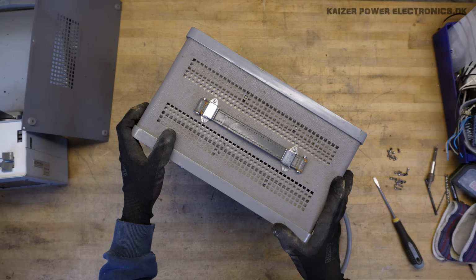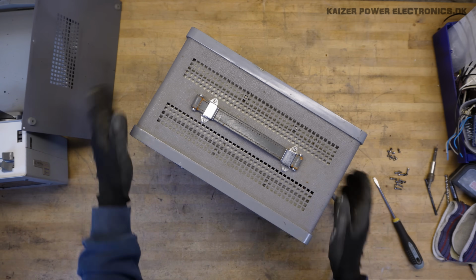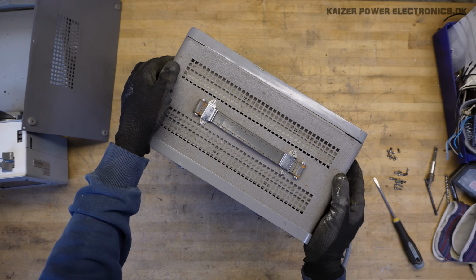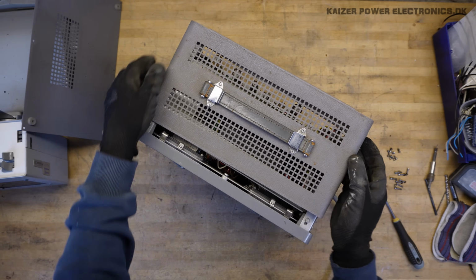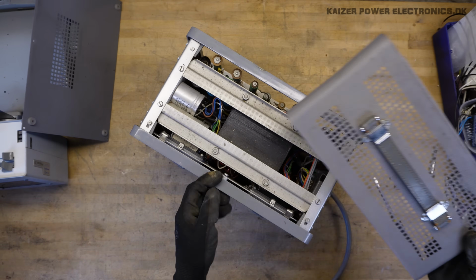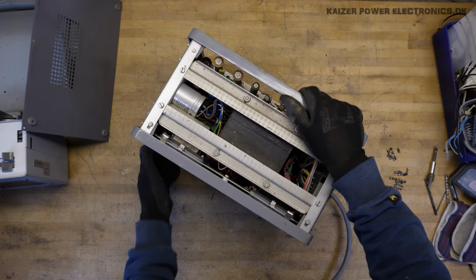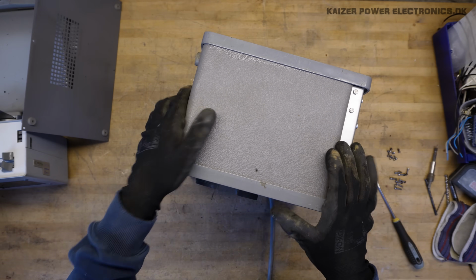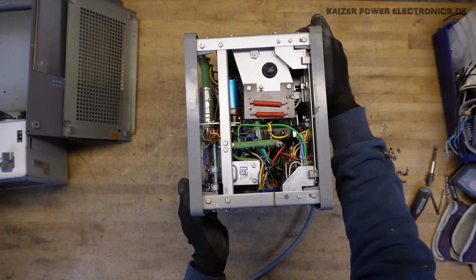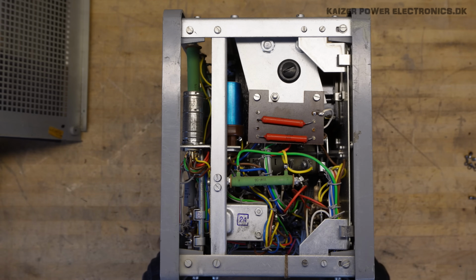This is quite a clever enclosure design. The only screws I had was fastened here at the back, and that is clearly holding all the cladding here. There's nothing on the front, but if I then pull this backwards, then it unlocks. It can just go past the back frame and you can pull it forward again. And all that held it in place was these 2 screws and then underneath the 2 frame parts. Very clever. So I assume we can do the same with the side and back panel. Just needs a little help. And in the very nice old school style, this is just absolutely packed with electronics.